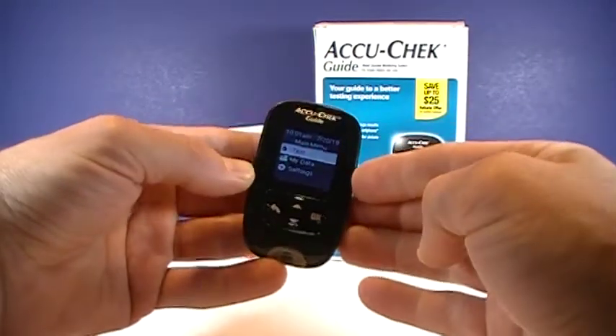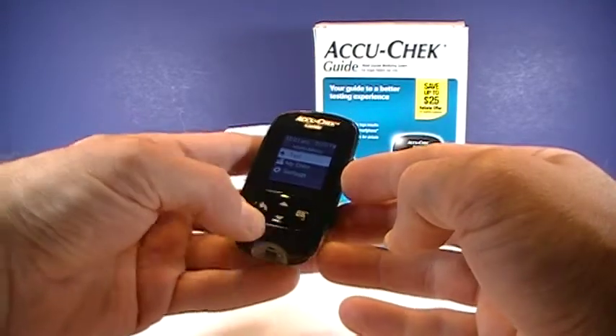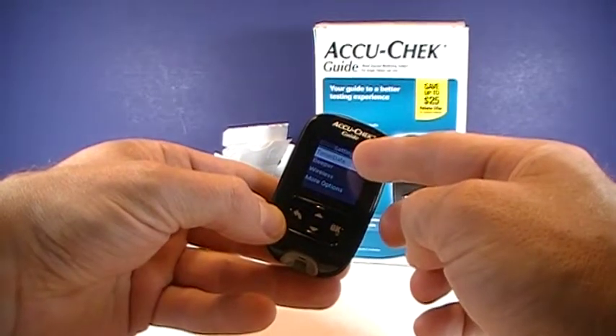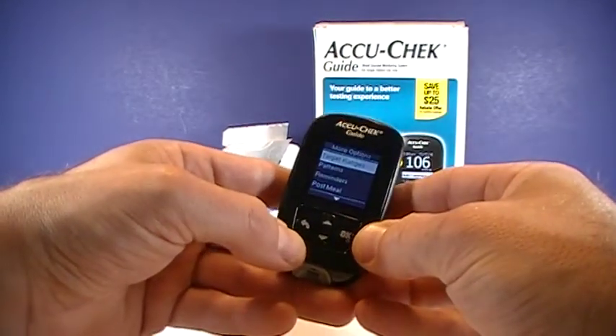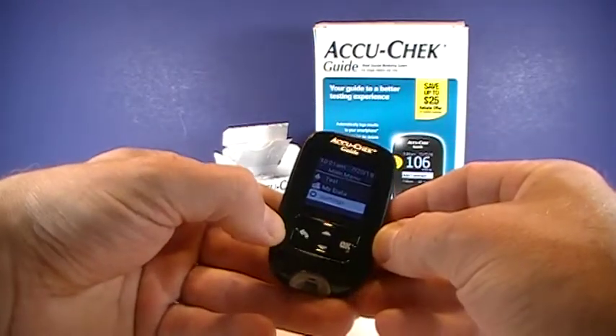So there, now we're ready to go. You can test, or you can go to My Data, or you can go to your further settings. Right there, we could fix date and time if you wanted to. Set your wireless options, more options, as well as your target ranges. And then this is your previous menu button.